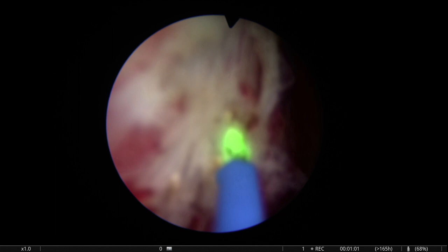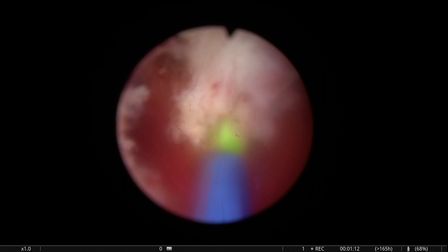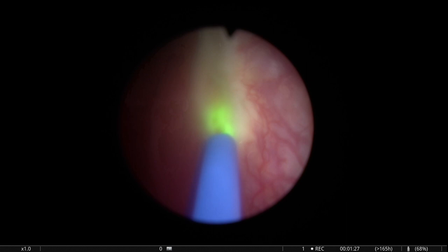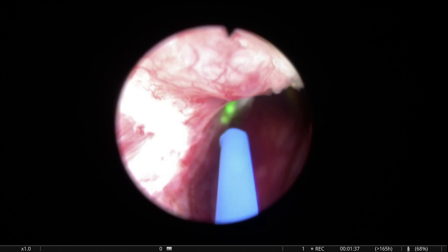Sometimes if you notice that hemostasis is not perfect, if you notice that the laser is not behaving like you would want to, and you wonder why is it bleeding more than usual, just think maybe I need to cut the tip of the fiber. With high power lasers, this fiber is breaking up all the time, and that's why it refreshes itself. And you can work more or less continuously.